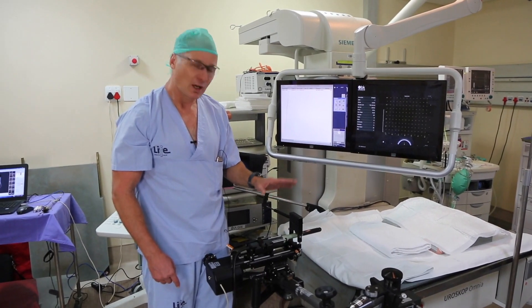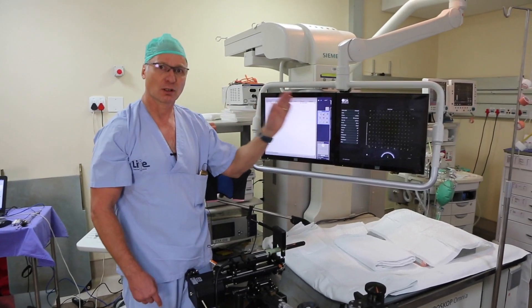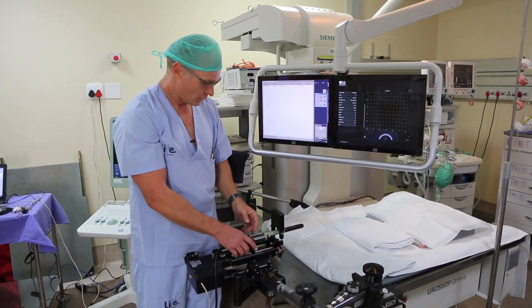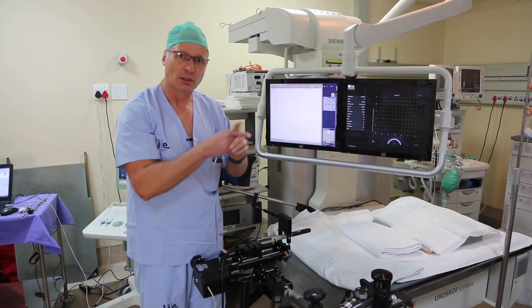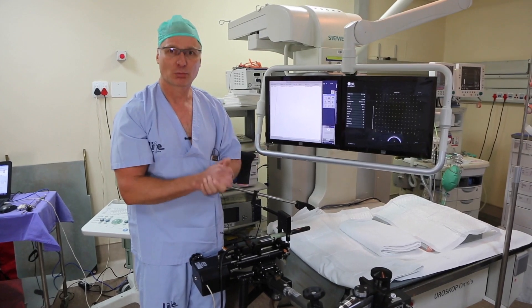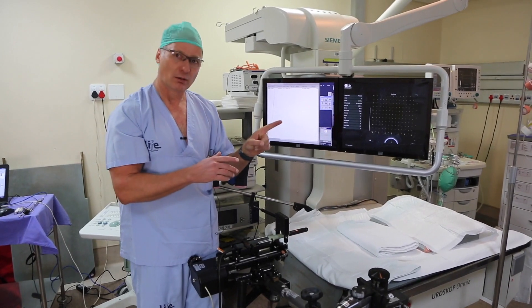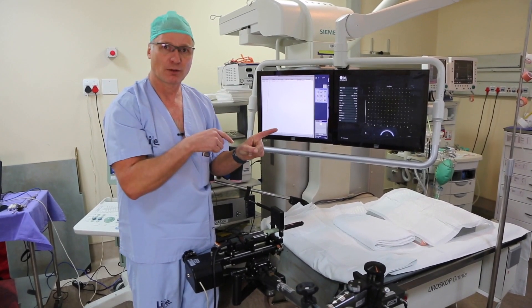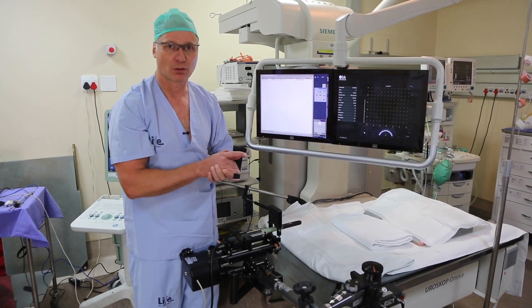Once this is done, we change the view of the ultrasound. So now we look at it longitudinally. Then what we can do is we can see the needle in the full length of the needle and then we can start placing the seeds. If we know that in one needle we need a seed at the tip, one in the middle, and one at the end of the prostate, we know where to put it and we can see it longitudinally on the ultrasound.